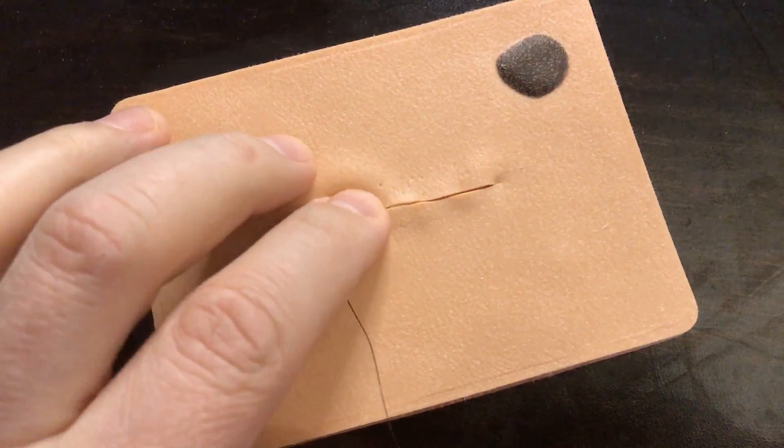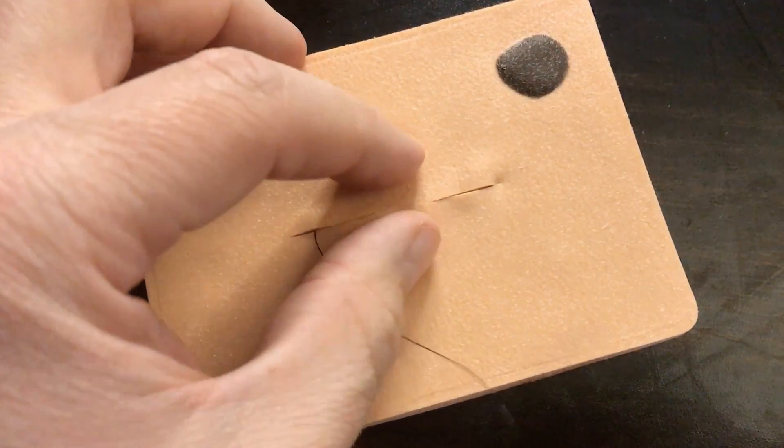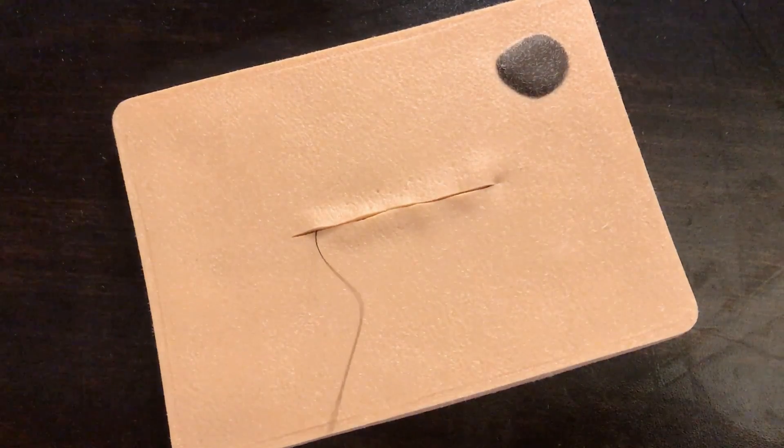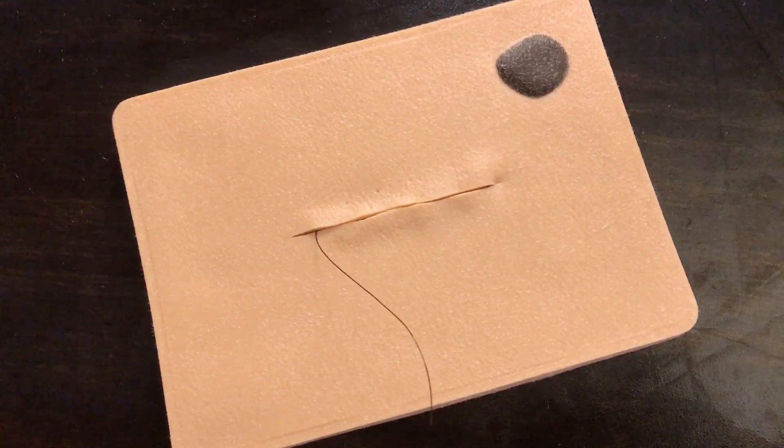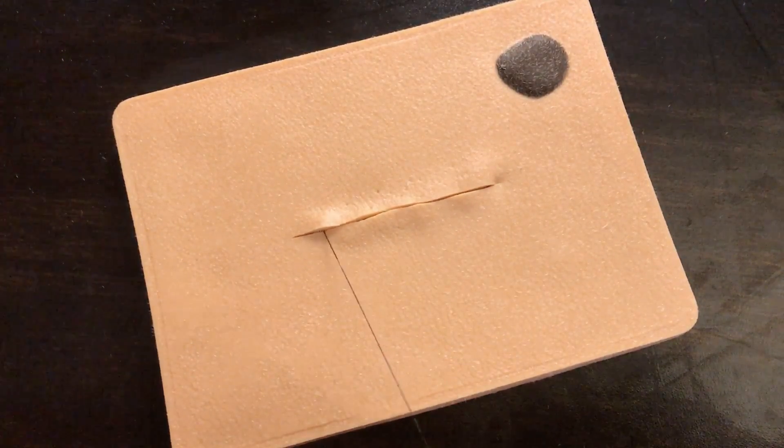So I'm going to give this a little tug, make sure we're nice and tight all the way across, being careful because the tissue we're passing this needle through is not very strong. Again, you want to make sure that you're using this suturing technique only if the skin edges are already pretty well approximated. And generally to reinforce something like this, as I'll mention here at the end, we place Steri-Strips over that to make sure that it holds strong while the skin heals.